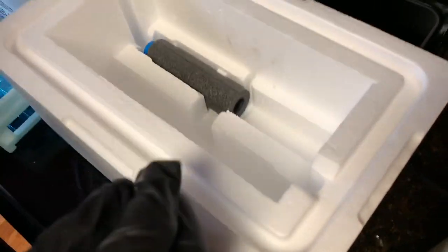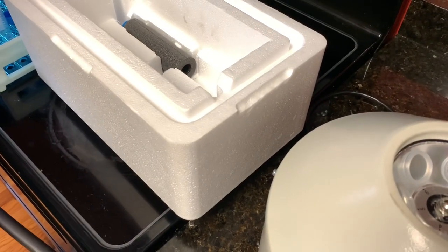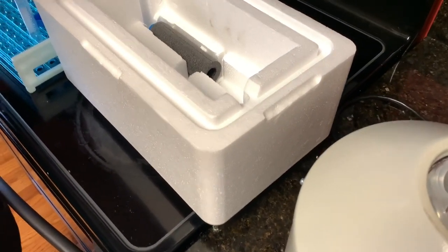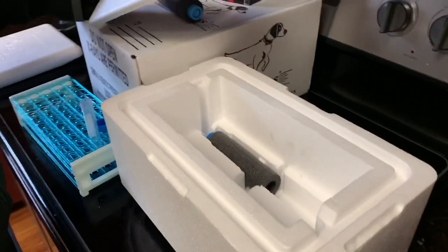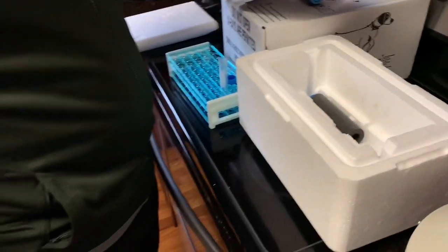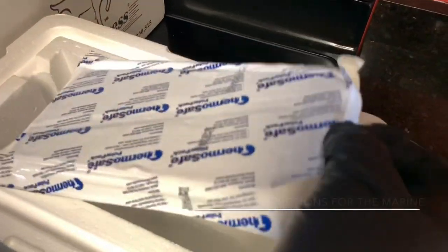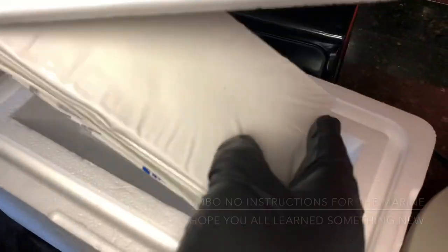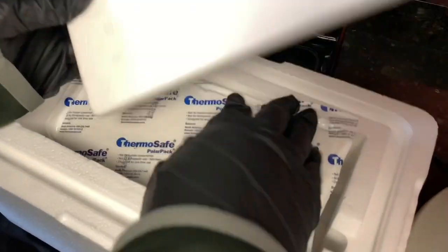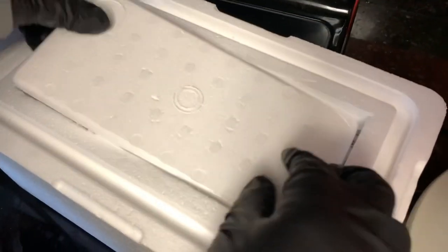You're gonna slide that in there, and Louis, it's on the top shelf. Right there. Yep. Ice pack to chill it. So ice pack to chill it, slide it on top. I think you had it the right way the first time. All right. This right here is an ice pack. We're gonna put the lid on it.